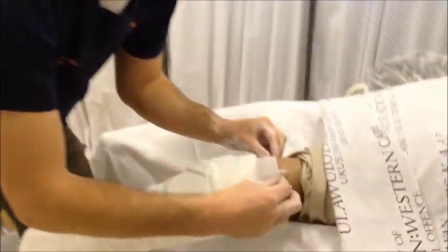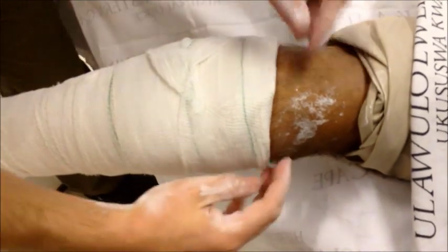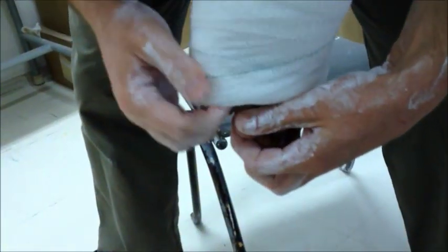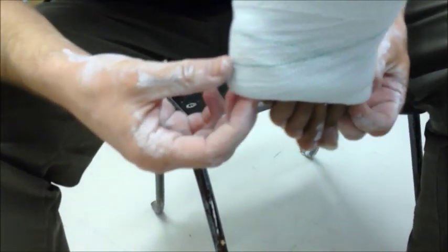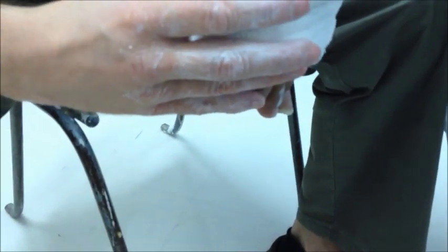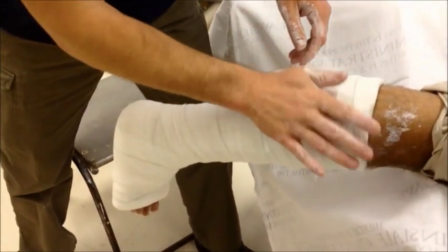I'll show you now why I like to wind beyond — what you'll do now is tuck this in. This creates another safety layer and it looks nice and neat rather than loose free wool sitting around. Do the same around the edge of the feet and the toes, just tuck that in. Do one final check around the toes — make sure you don't have any points digging into toes, and if you do, it's easy to just flare the plaster while it's still relatively soft. Make sure your peroneal nerve and fibular head area is nice and free.